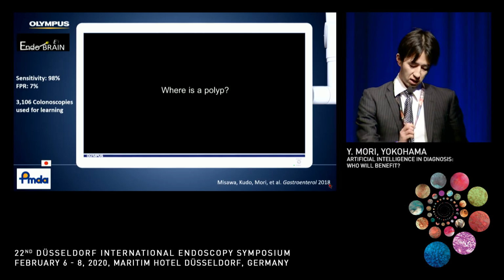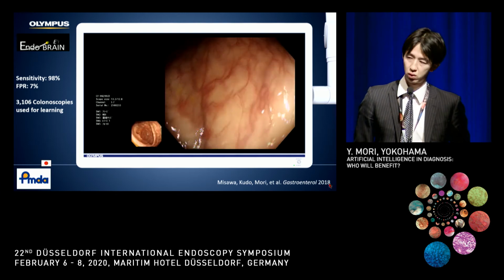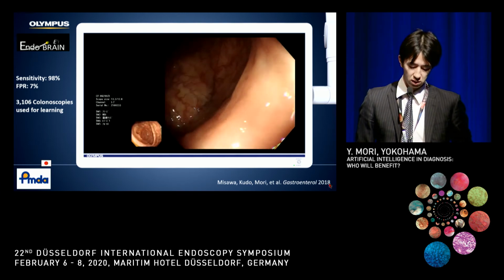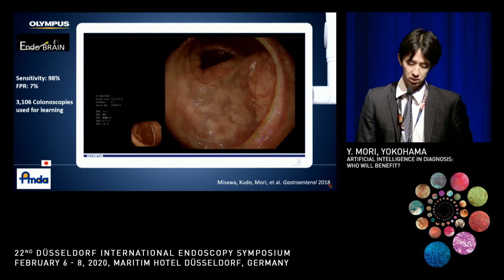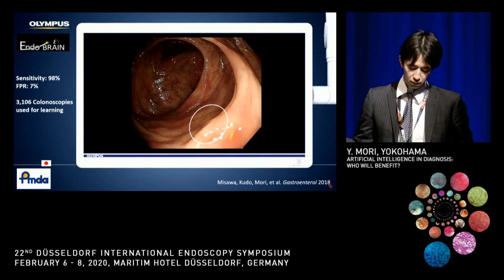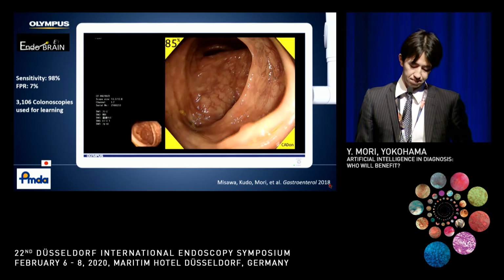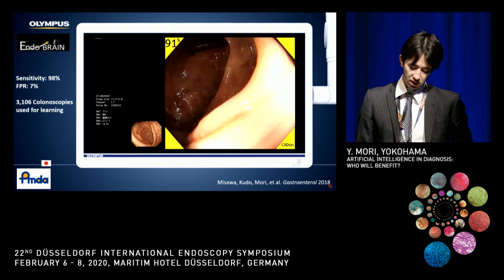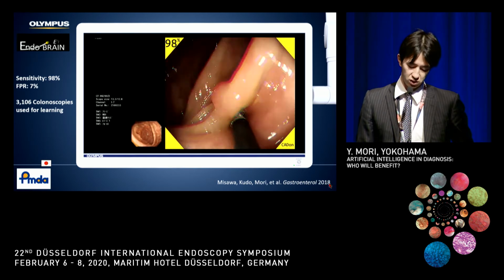And the next one is our collaborative project. Firstly, I'd like to introduce the video presentation. This is a video from our institution. There is a polyp. Can you find it? Actually, the polyp was behind the fold. It is a very challenging lesion. But if we use the AI, it can easily detect the presence of the polyp, even if this is a very challenging lesion.